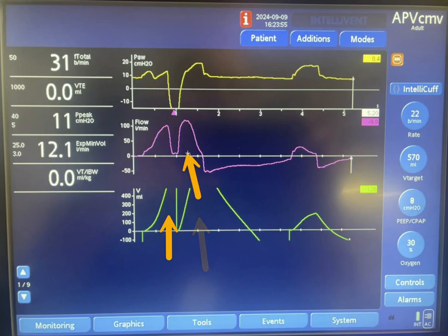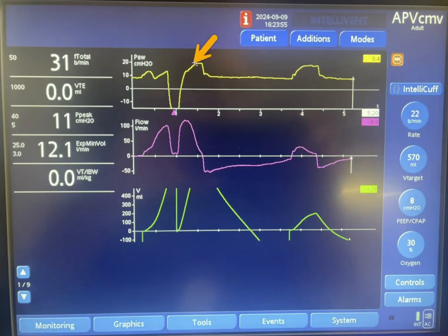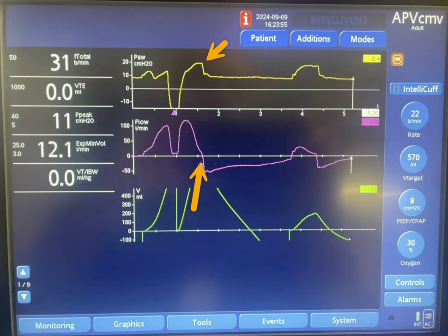The reason we have a larger tidal volume in the second breath is probably because of the patient's efforts — the patient continued to inhale along with the ventilator. Of course, you can also argue that the pressure utilized by the machine is slightly higher than the previous one. Now let's take a look at exhalation.